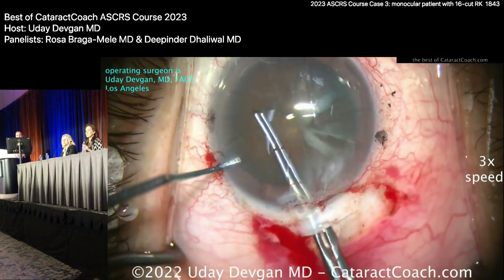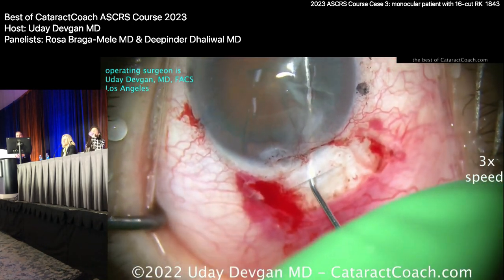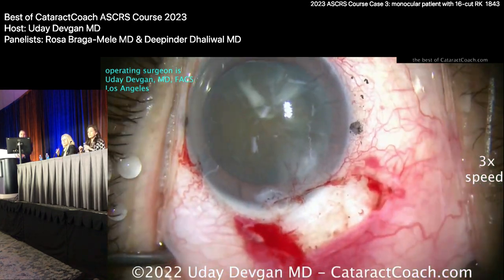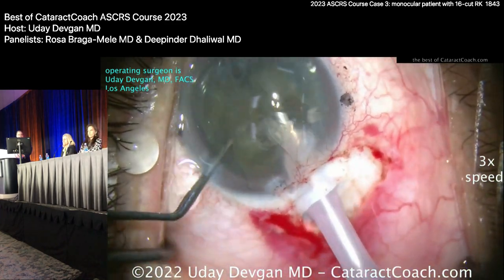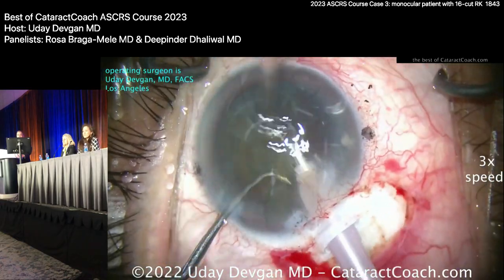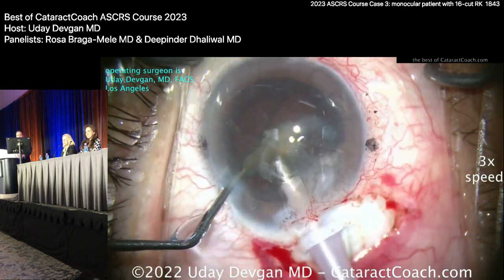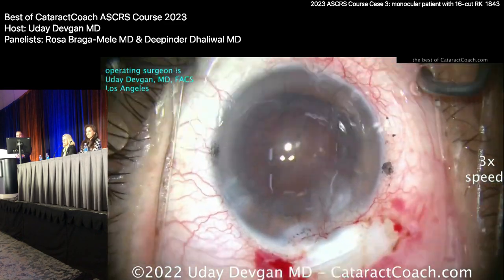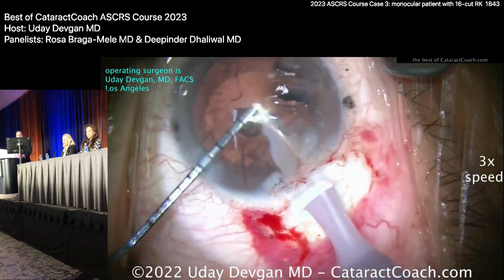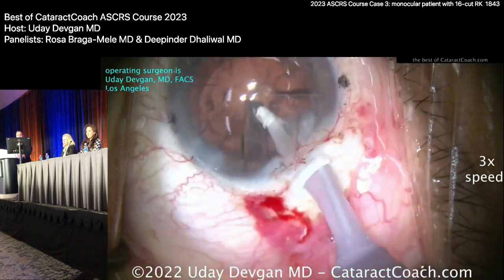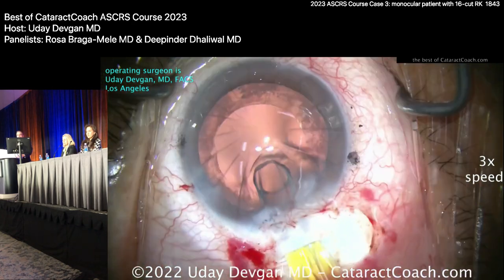The rest of the cataract part is pretty straightforward. Did you stain the capsule? You did. So we'll do a little hydrodissection, get this nucleus going. Even though it's a high-powered lens — I think it's like a 26 or 28 — obviously it's a myopic eye, so big axial length and a nice deep AC with plenty of room. I really want to operate in the iris plane because visualization in the bag is so poor with all those RK cuts, plus his arcus, plus those vessels I cauterized too much. We'll clean this thing up and adjust the scope lighting. A lot of pieces. Once this is cleaned up, I'll get the lens in the bag — and you know the story doesn't end here.